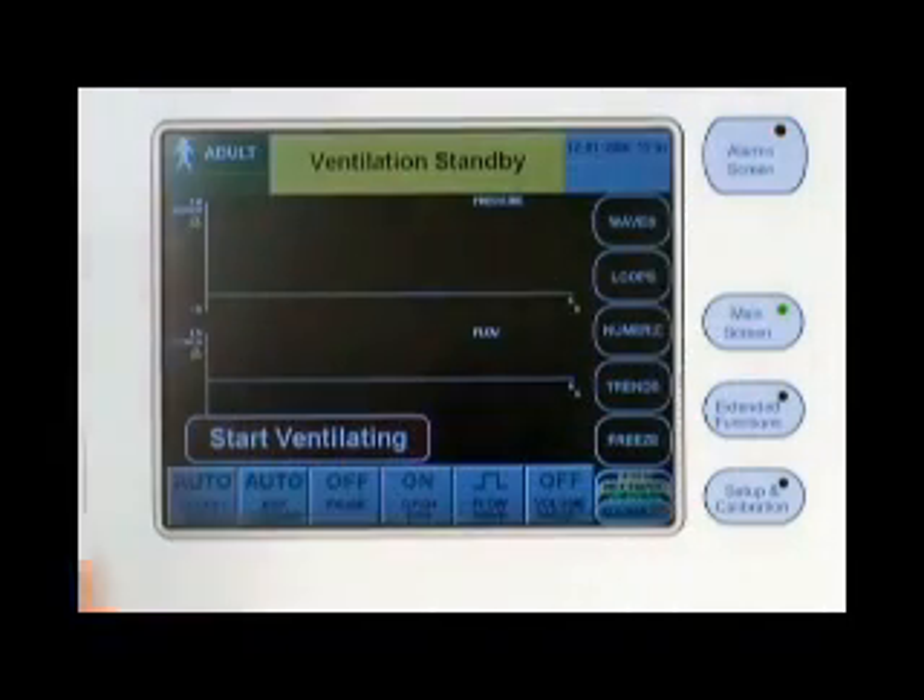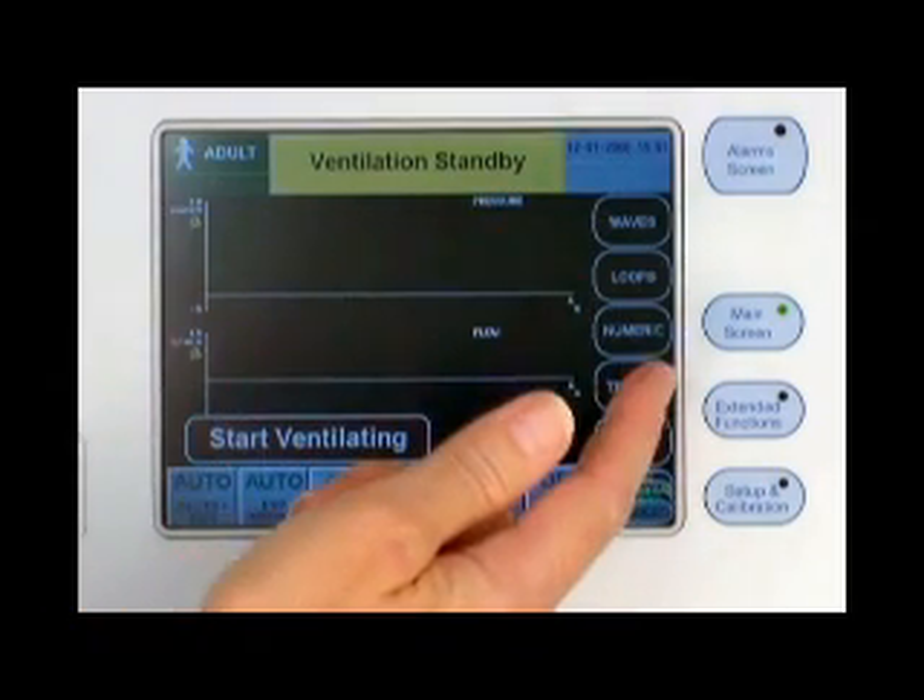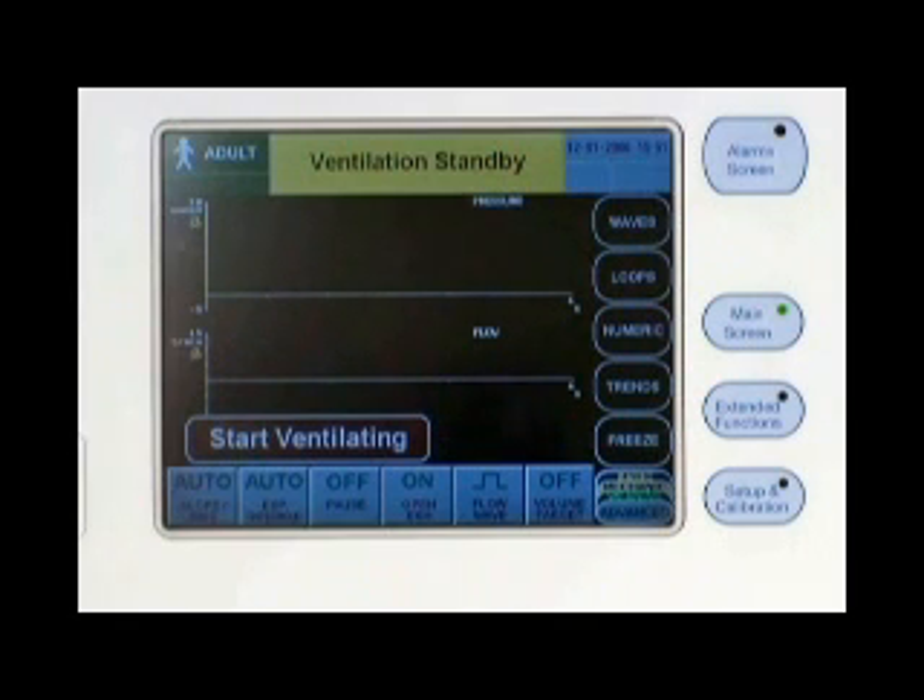The main screen menu button allows you to choose different screen displays. You can display different combinations of waves or loops, display a full numeric screen, or display two different sets of trends. The freeze button allows you to freeze the screen for better viewing or for saving to the internal memory so that you can download it as a bitmap file to a USB flash drive and view it on a computer.